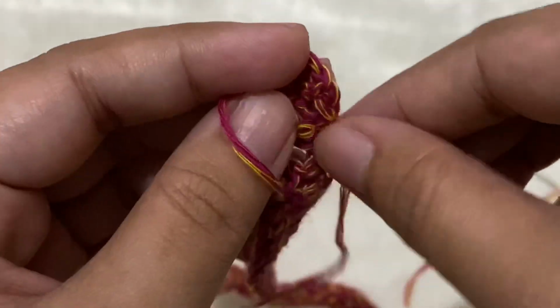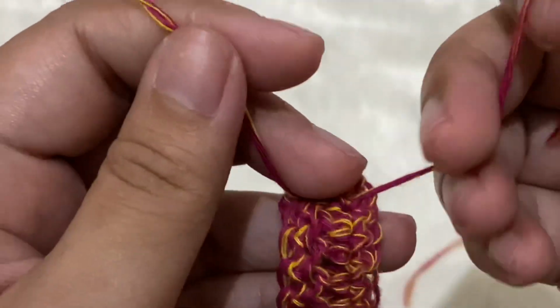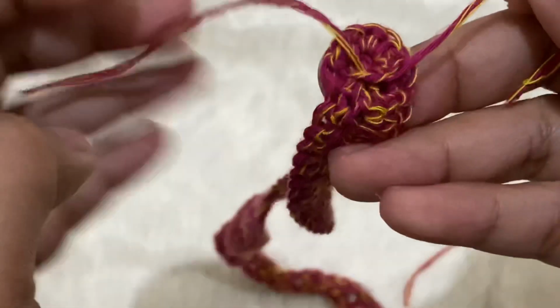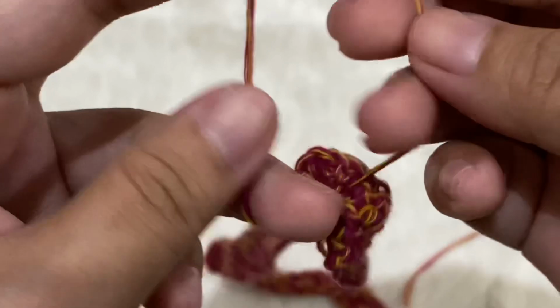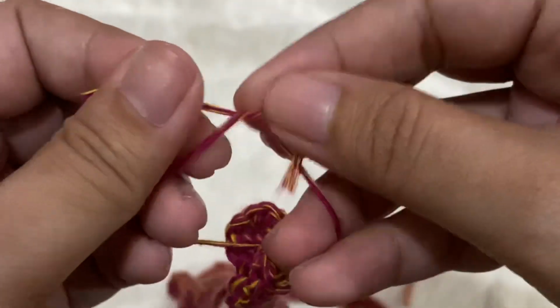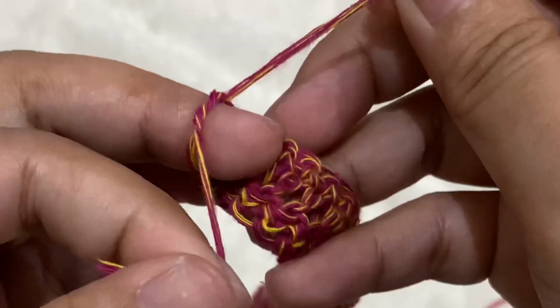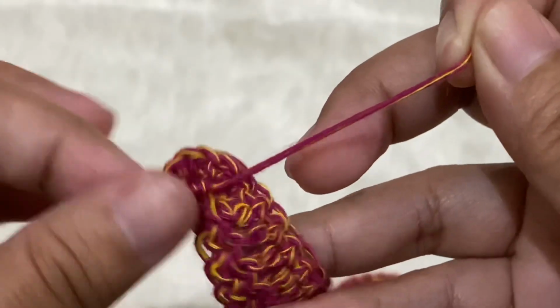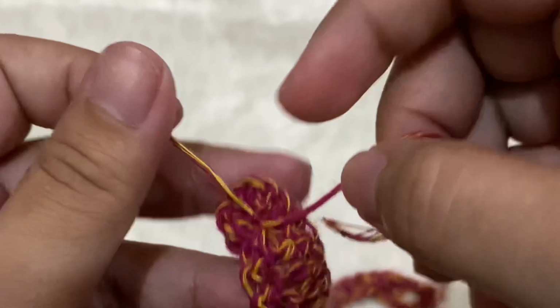So I will just tie them together into a knot like so. Okay, this is usually how I fasten these tails right there. So that's one. So I'm just making sure that it's tight right there, and then one more. Okay, this time I will wrap it like 3 times like that, and then tightly pull them apart like that. So this way I don't have to weave in the ends, because I don't like doing that actually.